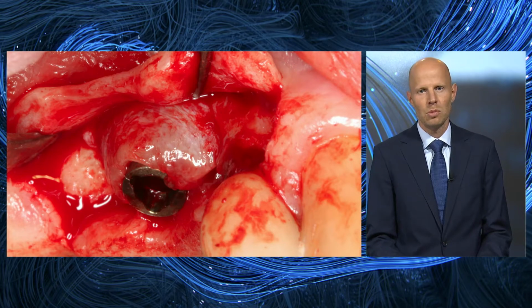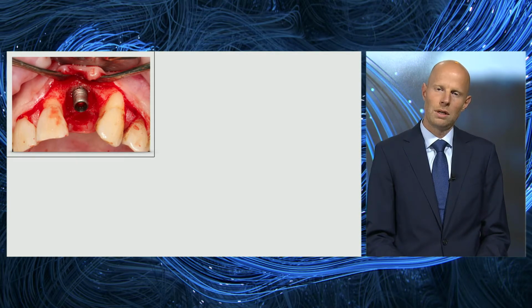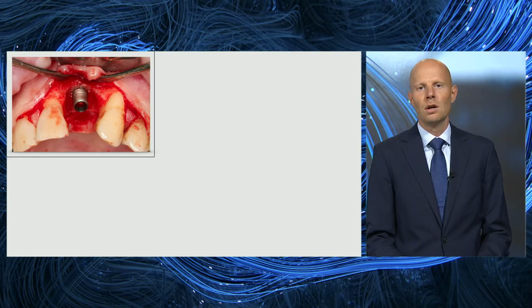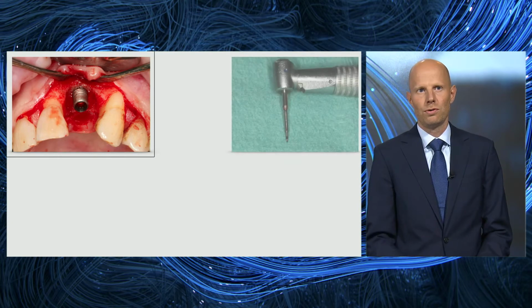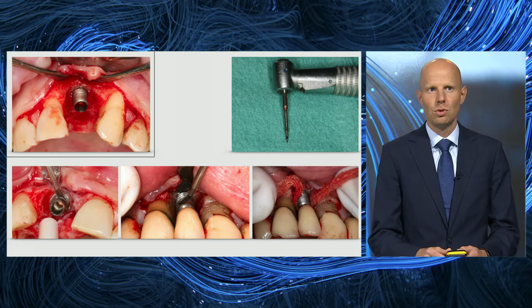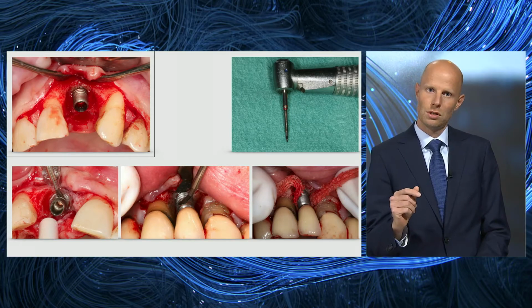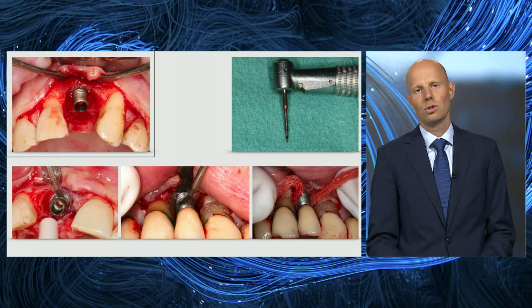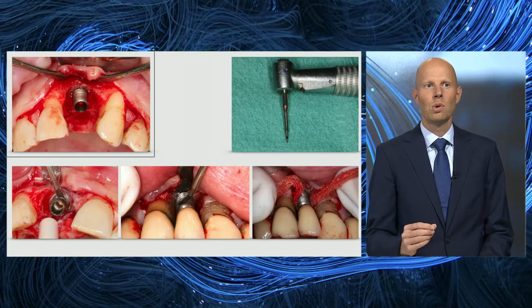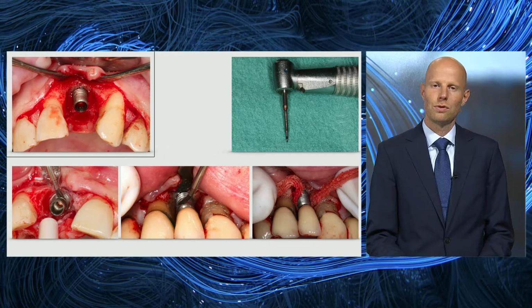In the next step, we remove this inflammatory lesion, as in the case in the upper lateral indicated before. We will now chip off hard deposits using titanium-coated instruments. And we will then use a rotating titanium brush to decontaminate the surface.